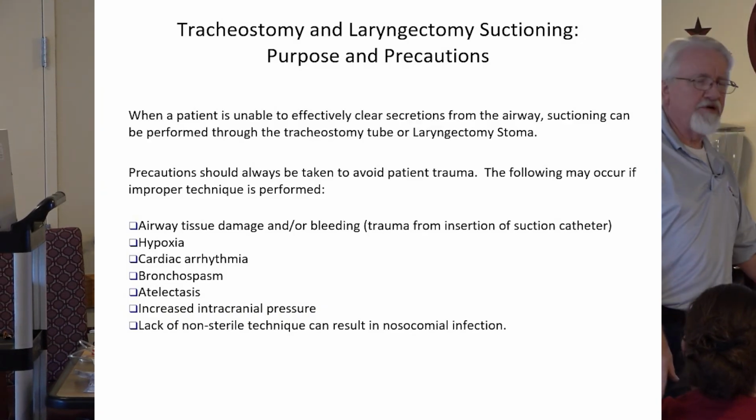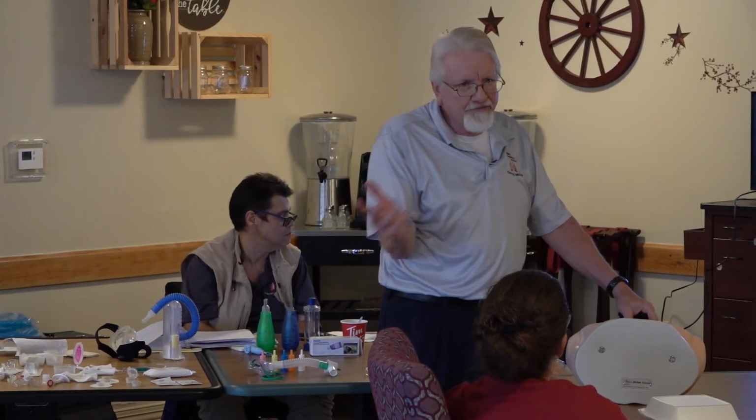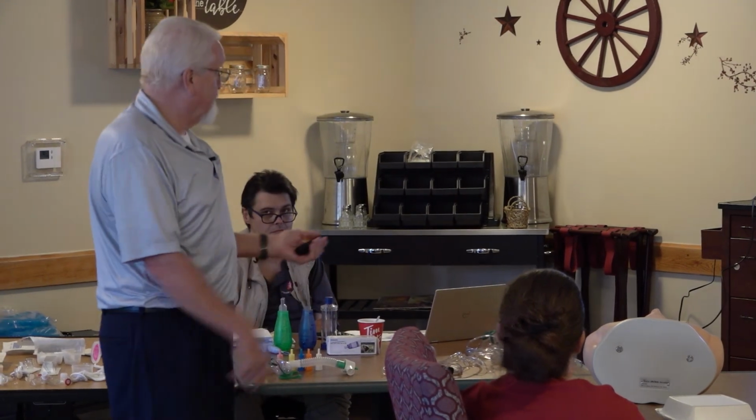Again, if you're using the single-use catheter and you're going in there to suction Bob, and that catheter's already been opened, please don't put it back in Bob. Get a new one, okay?